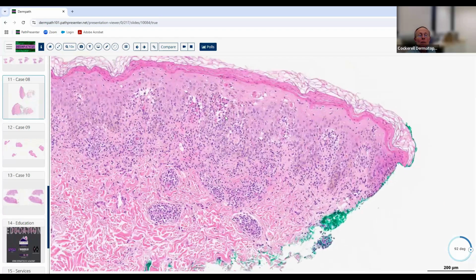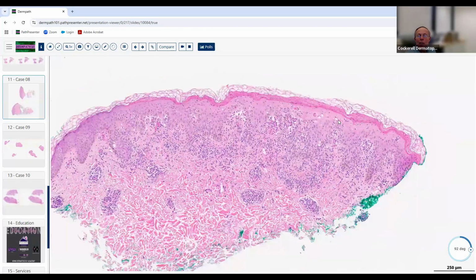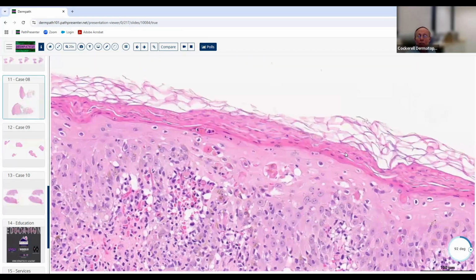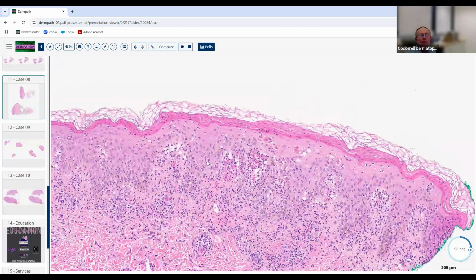While some of these cells are lymphocytes, a number of them are also neutrophils here. And we've also now got some other features in the epidermis that help us. We've got lots of vacuolar alteration here. So we talked about vacuolar as being one of the types of interface, and it's got maybe a little lichenoid inflammation, but it's mostly vacuolar. We've got these pink structures in the epidermis, which are necrotic, dyskeratotic keratinocytes. We've got these broad zones of parakeratosis that contain neutrophils within them, so it's almost like a broad wafer-like parakeratosis. And then we've got extravasated erythrocytes here.